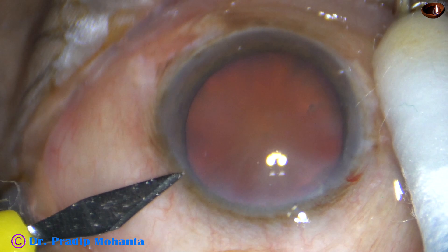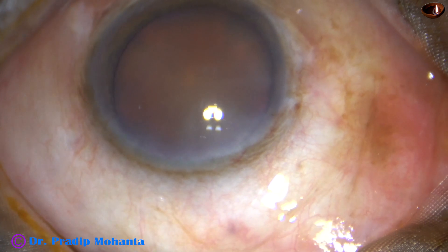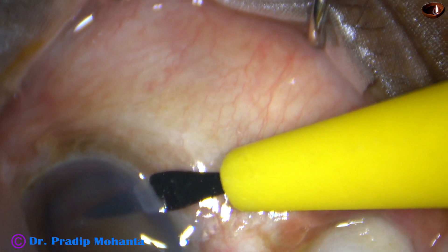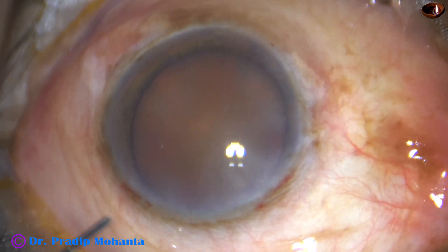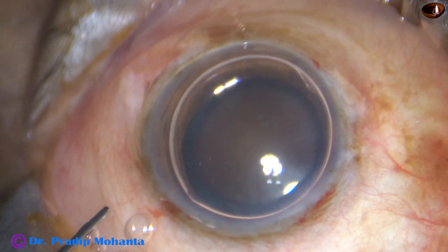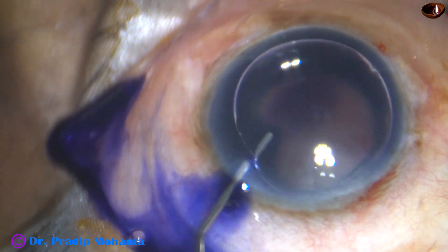By this time, the main incision has been made. And now, two side ports are made. In this case, I want to stain the capsule with Trypan Blue dye, and I always do that underneath an air bubble. Here goes the Trypan Blue dye.